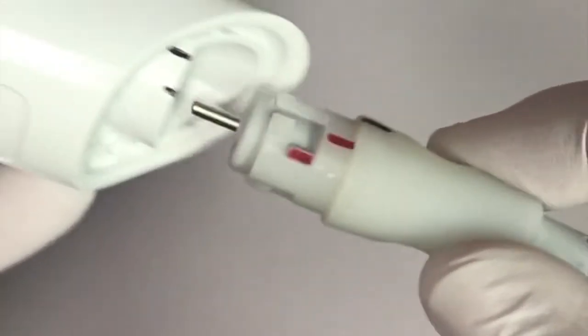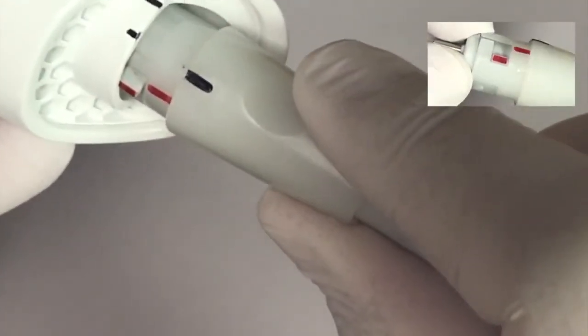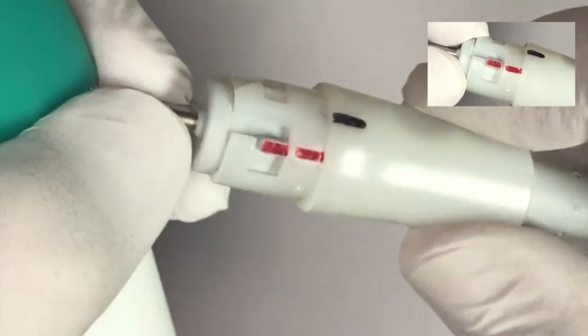If the base of the cable is twisted, it will not insert into the back of the scanner. Adjust the cable base and reinsert.